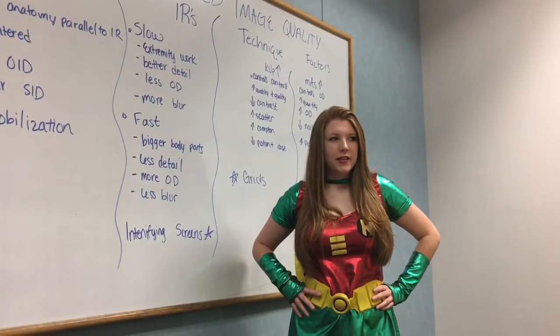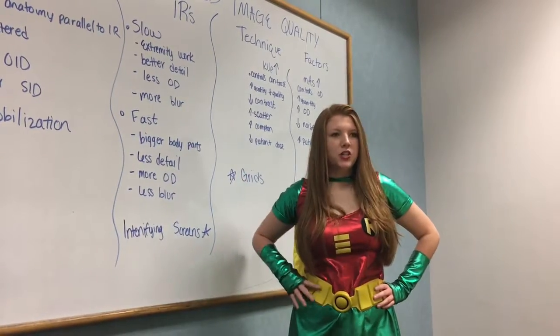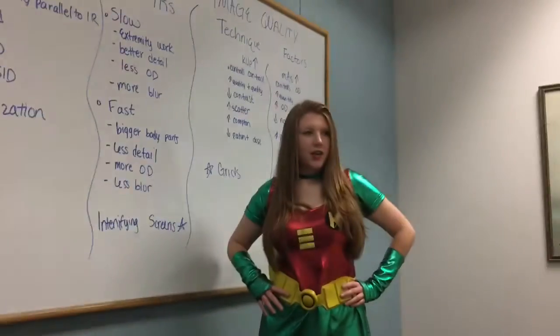Now, what has been added to the IR to reduce patient dose? Intensifying screens? Good job, Michaela.